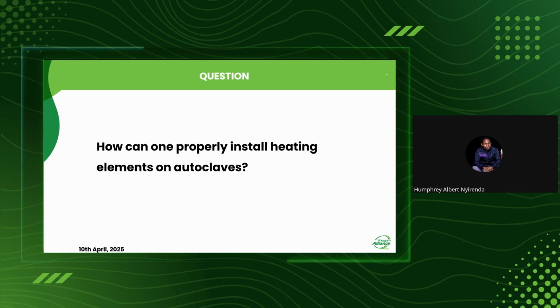With the star connection, as my colleague has explained, say you have three elements. You feed each of these three elements with a single phase, and then you feed the remaining part, which is supposed to receive a neutral, with a single neutral.